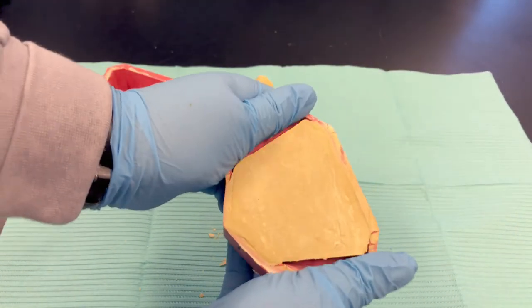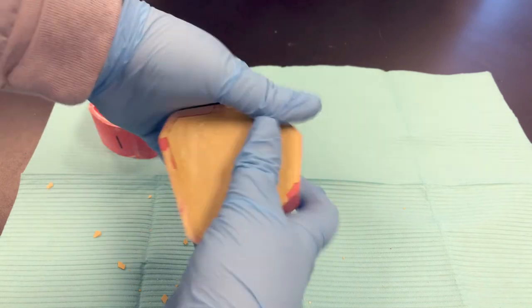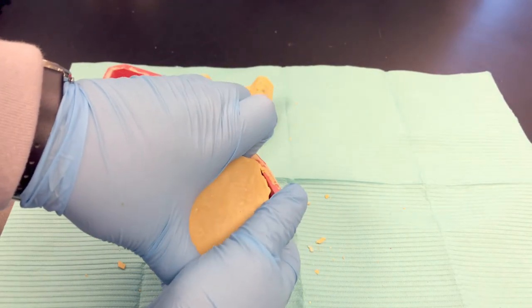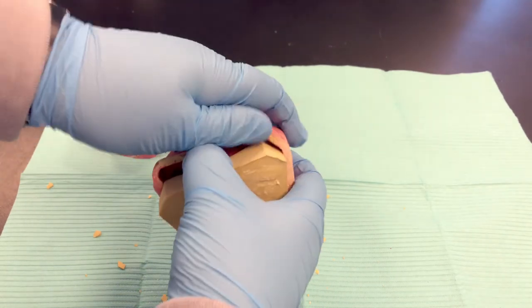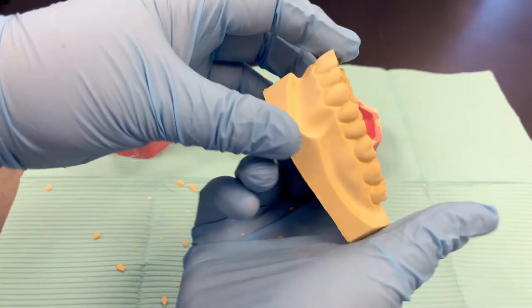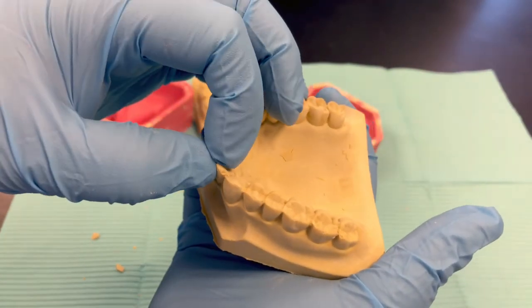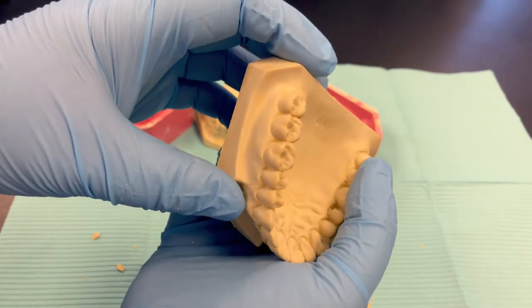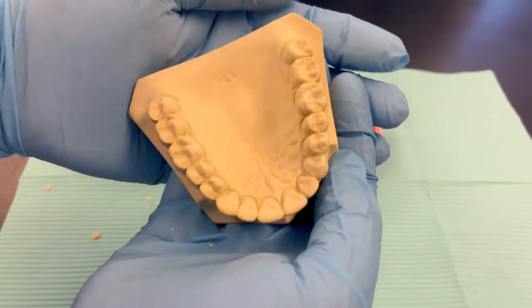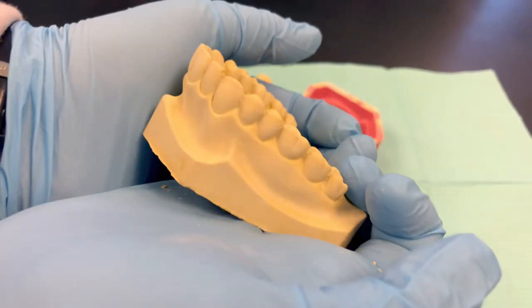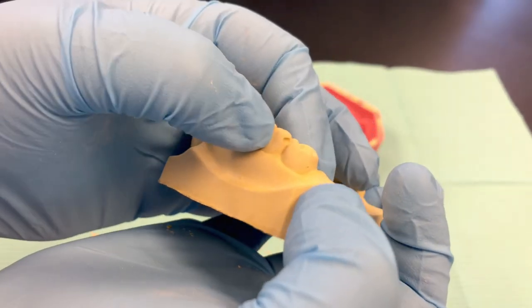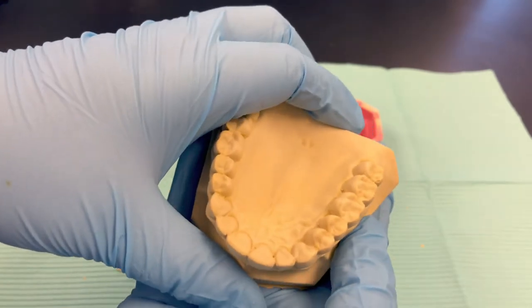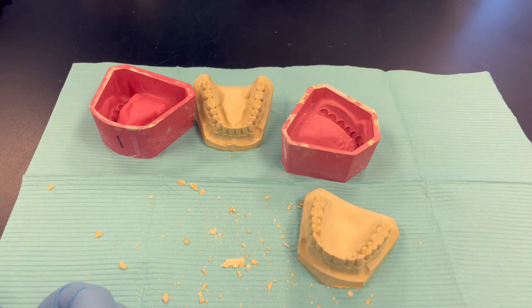To separate, flex the edges and then push up from the bottom. Take a look at this one. Bubble up there. Again, bubbles on the base, but the base does not matter as much as the teeth. So this one looks pretty good. Another bubble back here. So these are pretty good study models. A few bubbles on each one, but not enough to affect anything that I might make for this patient.